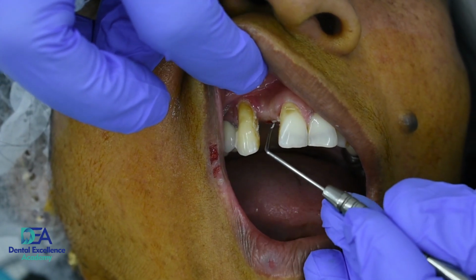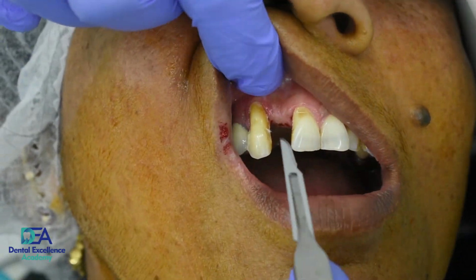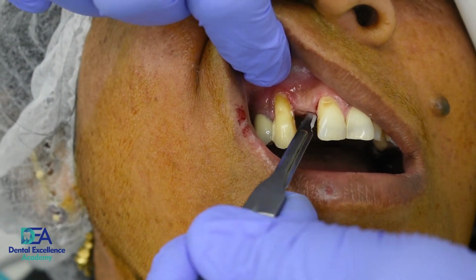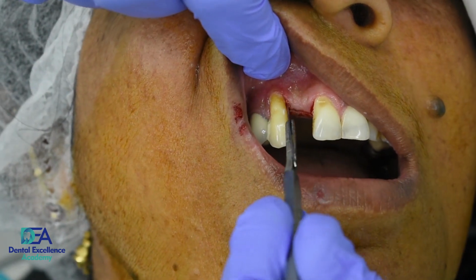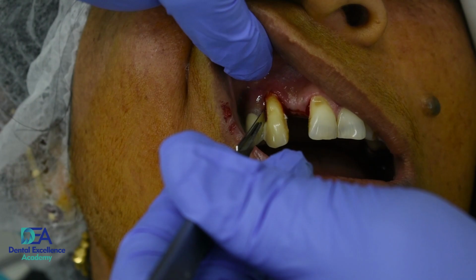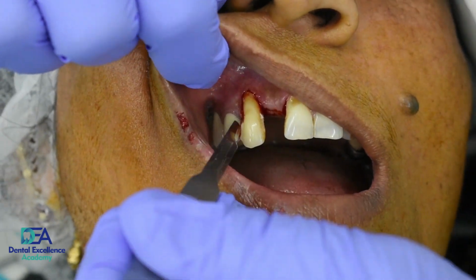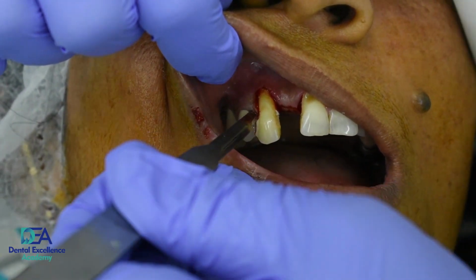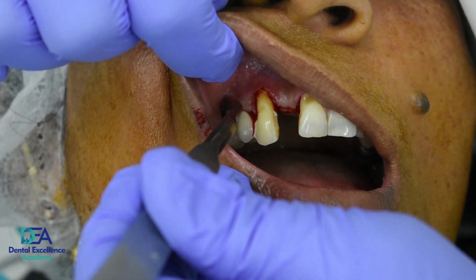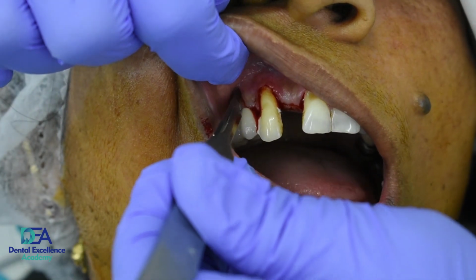So I'm starting with the crestal incision. And now I'm giving the sulcular incision.